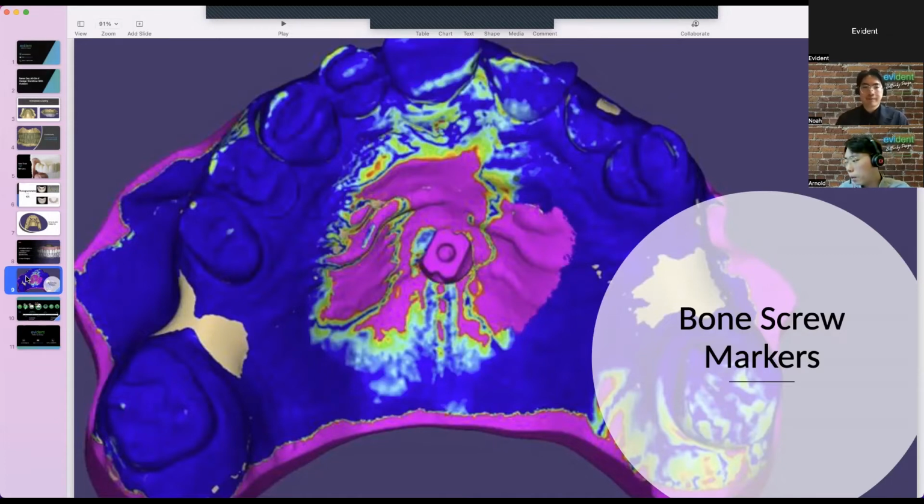For example, PMMA acrylic is almost at 50 to 60 megapascal, whereas Ceramco resin material is like 130 megapascal. And I actually tried to print it out, and then I tested the flexural strength, and it's pretty strong enough to insert it as a long-term temporary provisional.